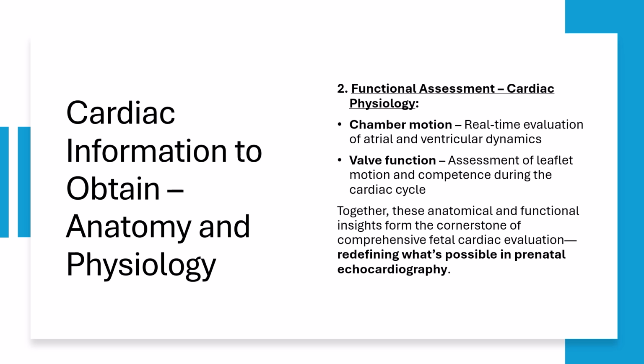These dynamic assessments give us vital clues about hemodynamic efficiency and functional integrity, helping detect conditions that may not be obvious on structural analysis alone. By uniting both anatomical precision and physiological insight, 5D Heart doesn't just visualize the fetal heart, it elevates our entire approach to prenatal cardiac evaluation, making it more comprehensive, reproducible, and clinically meaningful.